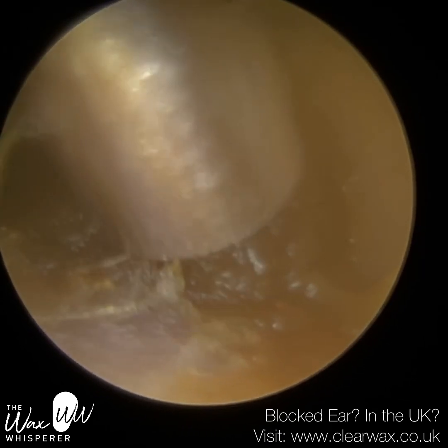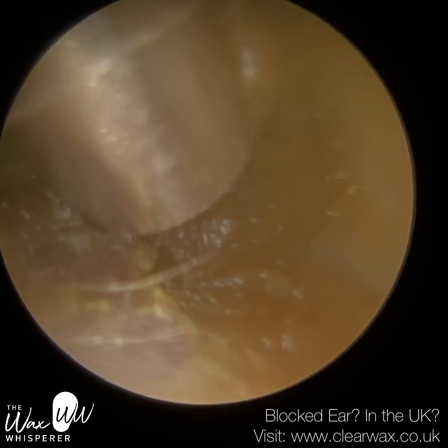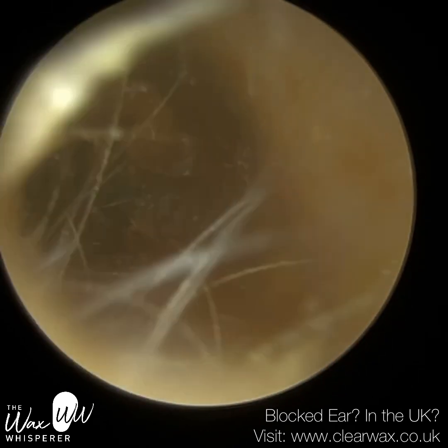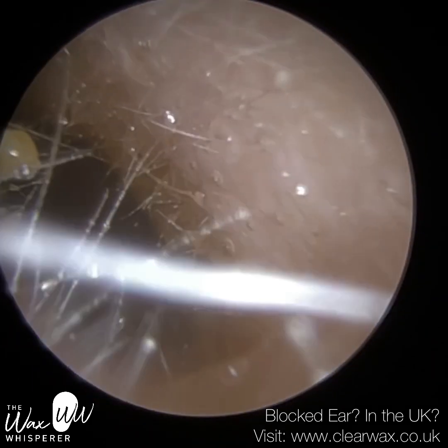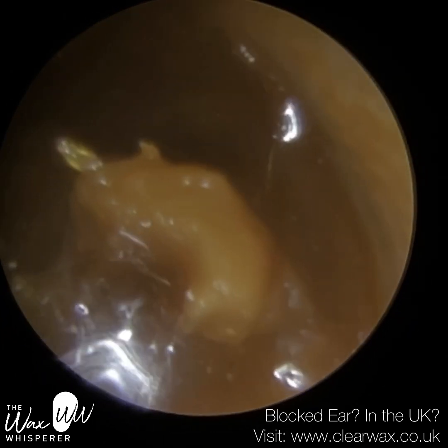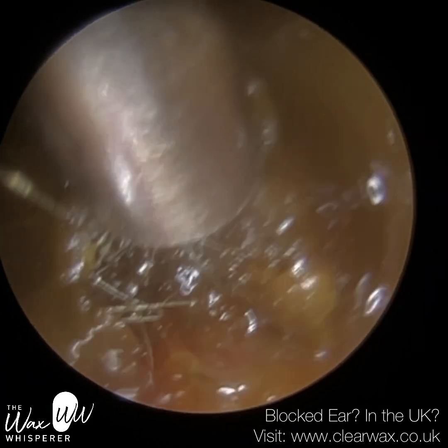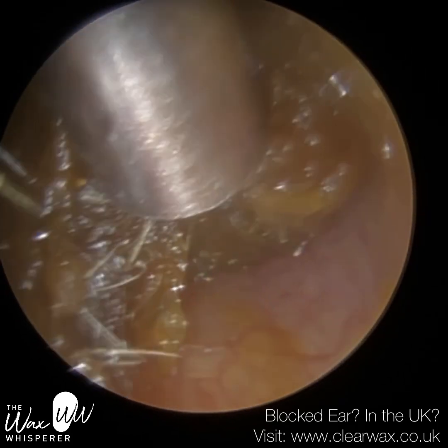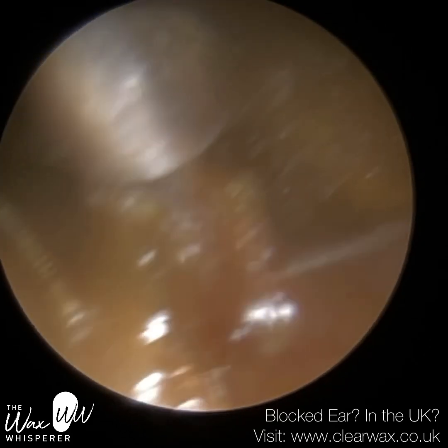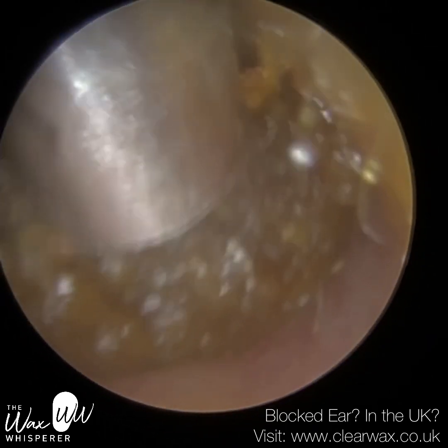When you've got a consistency of wax like this, it's very difficult for it to travel up the suction tube, and even if it does, it's prone to getting blocked inside. So immediately I've reached out for olive oil spray, and we are now suctioning whilst the oil's in situ. I've not drained the ear, I've just filled up the ear with the oil, and whilst the oil's in, I'm continuing to vacuum.